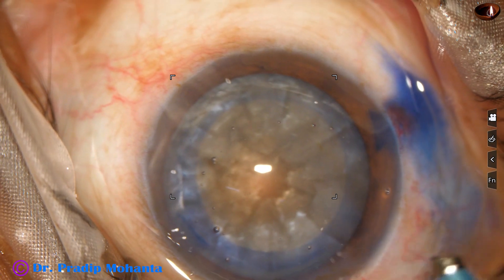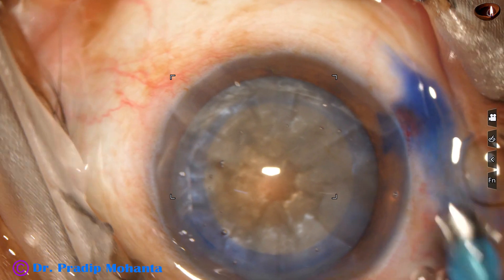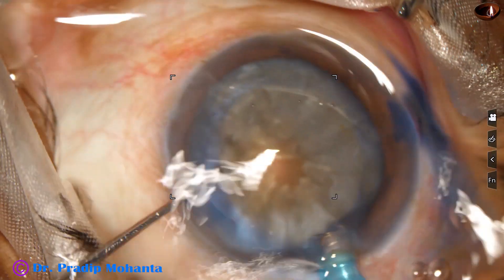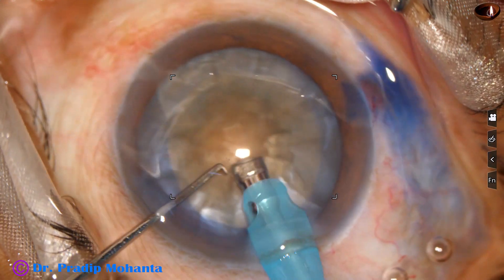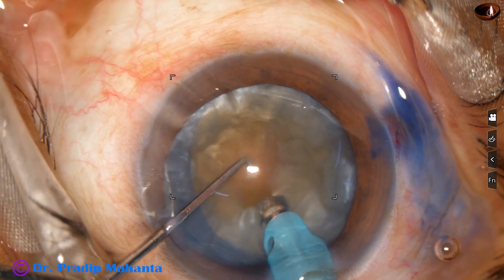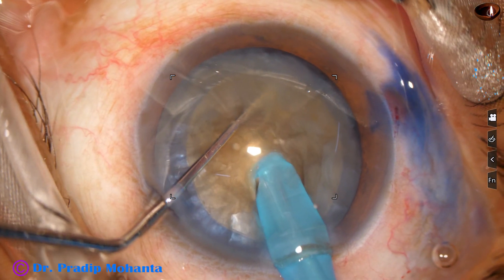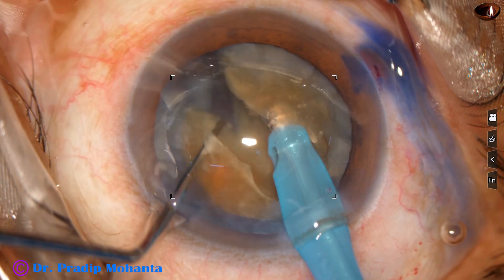Inject Viscoelastic again. Now is the time to introduce the handpiece — notice the phaco needle goes in with bevel up in this case. Now watch submarine chop: the tip is buried into the substance of the nucleus, travels through towards the opposite equator, and the nucleus is chopped.